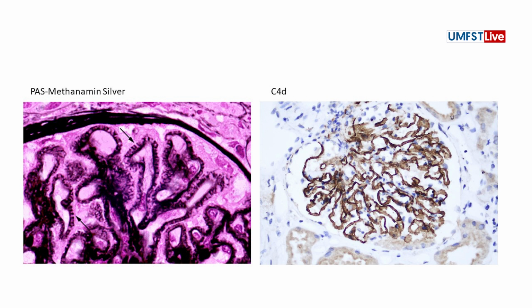And, sorry, these are the spikes. But these spikes are the collagen. The empty places are the immune complexes. And these spikes are between those nodules. That's why we see it like that.